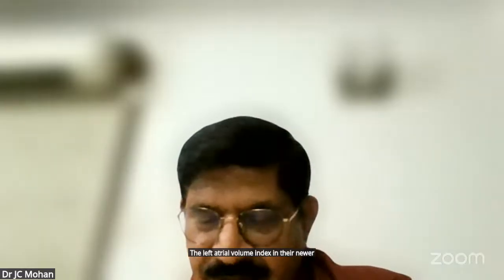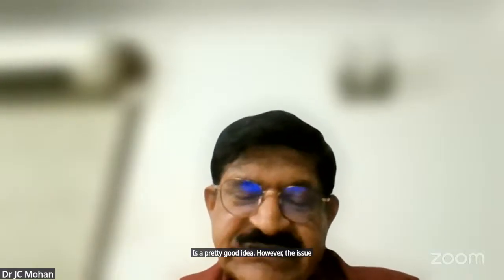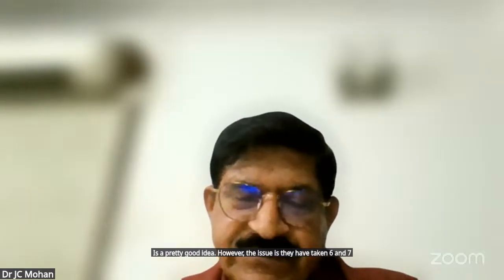The third part was about the E prime, that is, the whole issue of starting the diastolic assessment with E prime is a pretty good idea. However, the issue is they have taken 6 and 7 as septal and lateral, and average 6.5. My point is that in elderly individuals, especially in South Asians, these criteria would actually fall flat.